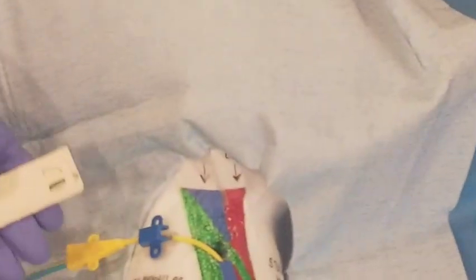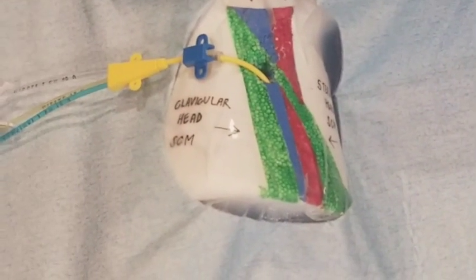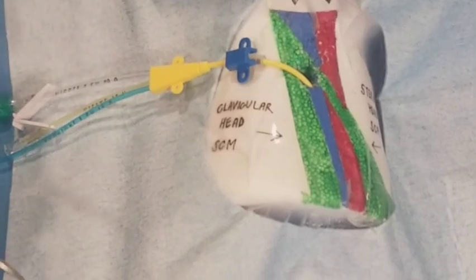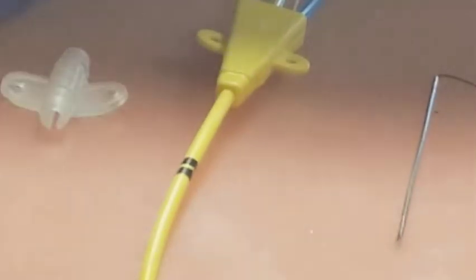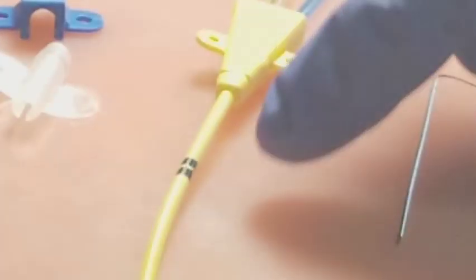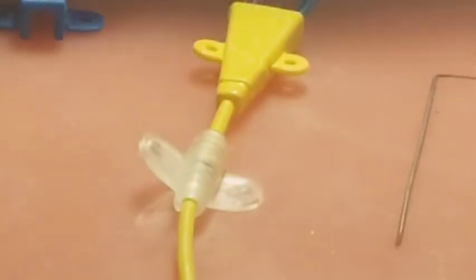So I have a 3/0 silk suture and I have my needle driver, and I can keep my scalpel here just to cut the suture when it's the right time. We have two fasteners here. These two double black lines represent 20 centimeters. So you want to secure the line in place with this white plastic closure, and then cover it. This will snap into place with the blue.